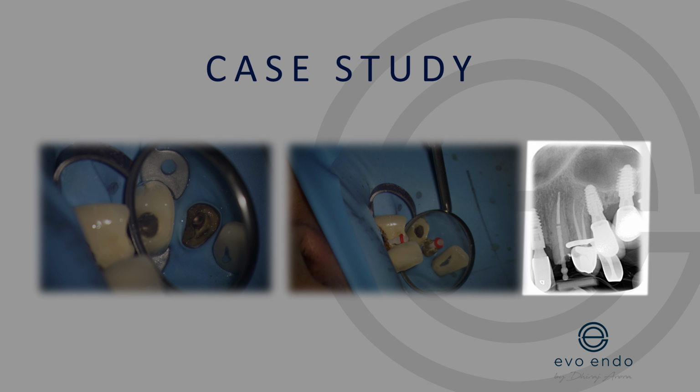And for me, planning a post is the most important thing. I need to know how long a post I want to place. I want to know how wide a post I can potentially place. And remember, the golden rule is to preserve as much quality and quantity of tooth structure. So I am trying to place a post as passively as I can to the ideal length, which usually is quoted for fiber posts as half the root canal length or within 5 millimeters of the radiographic apex. We don't want to go any further than that.